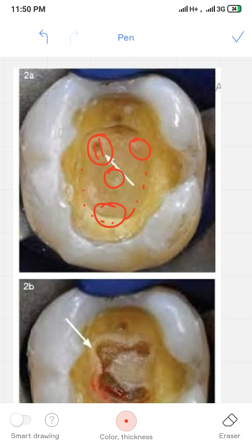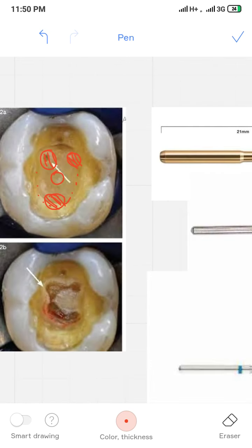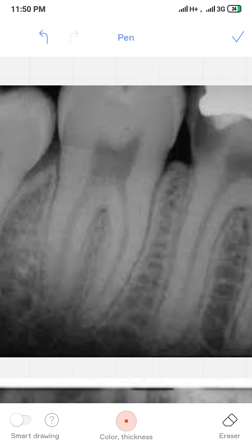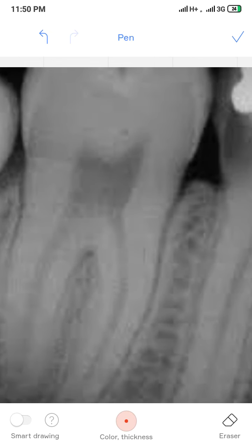These three places will be your ideal places to get that drop-in feeling, because if you look at the shape of the chamber, notice the distance between roof and the floor is greater in the regions of the canal. That means when you are getting that drop in, there is less risk of doing damage to the floor, because this tooth is ideal, right?